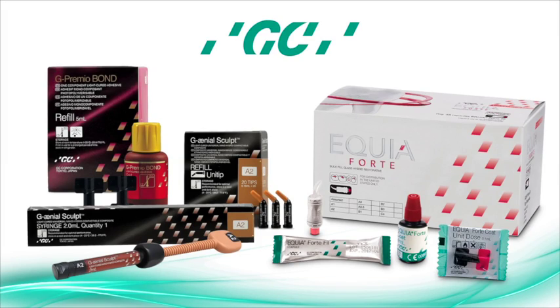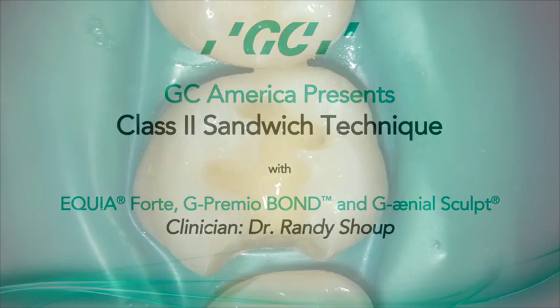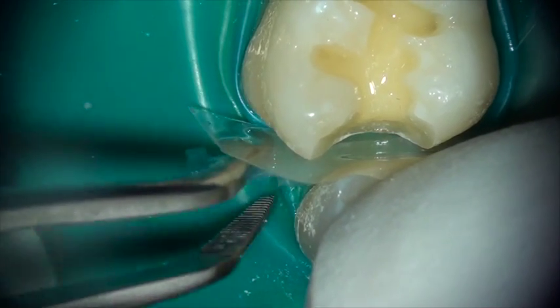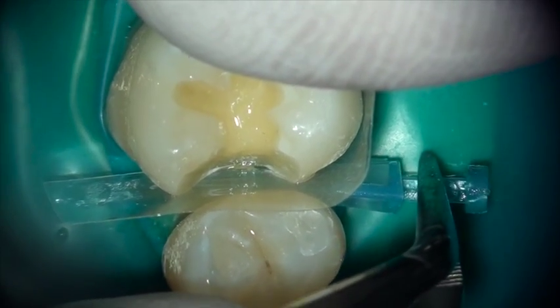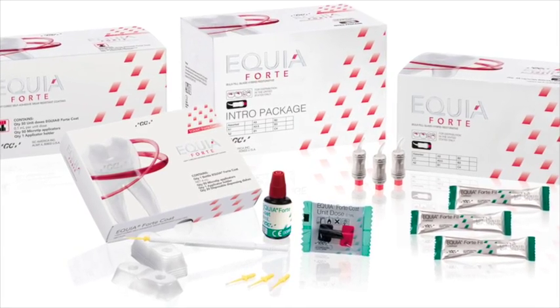This is Dr. Randy Shoup for GC America. We're going to look at the Class 2 Sandwich Technique. It's so common for dentists to find that their preparation extends beyond the limit of the enamel down onto dentin and cementum. This is where you need a bulk fill, fluoride-releasing restorative material, and Equia Forte is the perfect choice — a glass hybrid restorative with amazing physical properties.